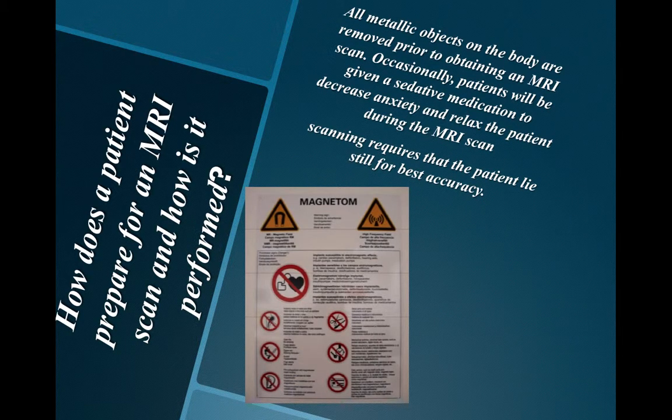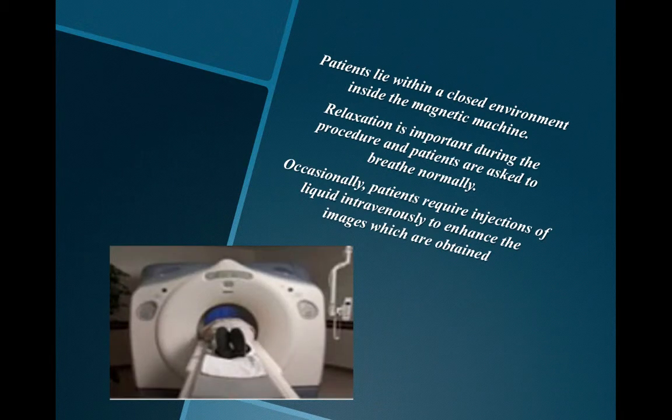How does a patient prepare for an MRI scan and how is it performed? All metal objects on the body are removed prior to obtaining an MRI scan. Occasionally, the patient will be given a sedative medication to reduce anxiety and relax the patient during the MRI scan. Scanning requires that the patient lie still for best accuracy.